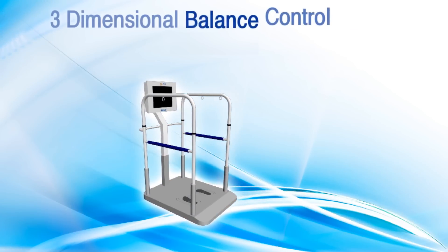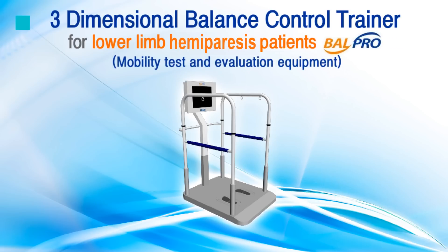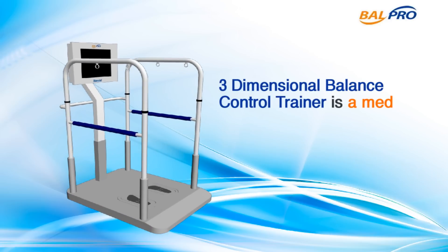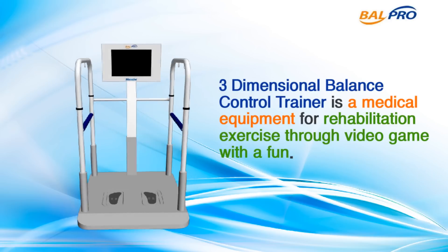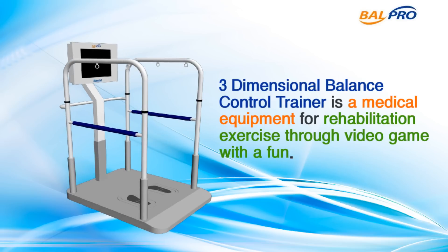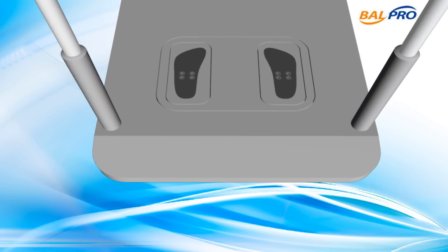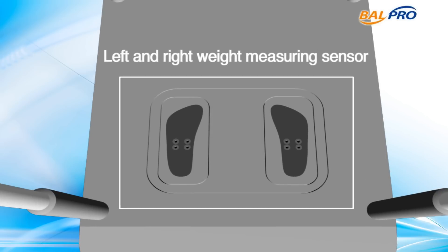Manantel Company Limited's Balpro 3-Dimensional Balance Control Trainer is a state-of-the-art medical equipment composed of a device that tests and evaluates body mobility, as well as a manual function recovery device. It is the world's first rehabilitation equipment that applies vertical movement exercises such as knee bending and flexing.